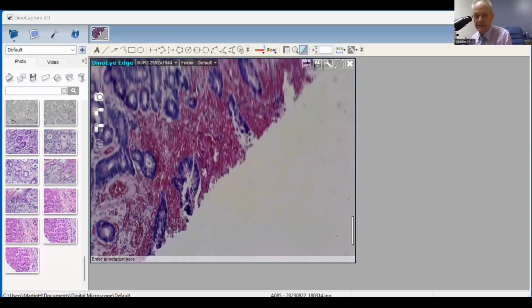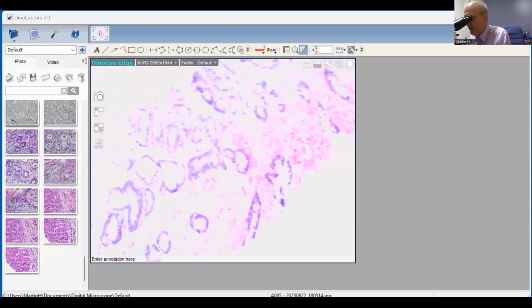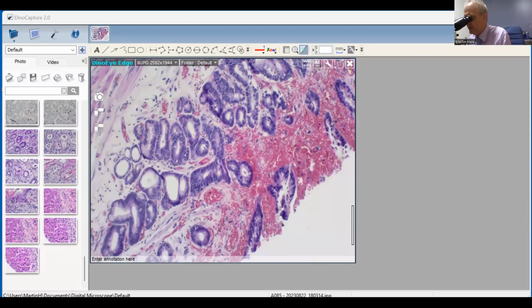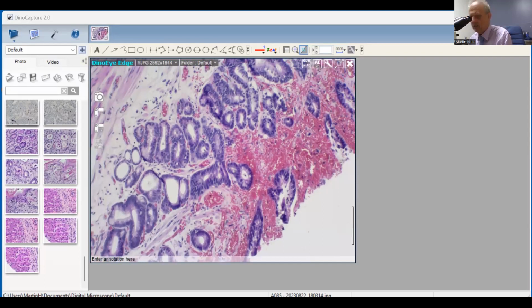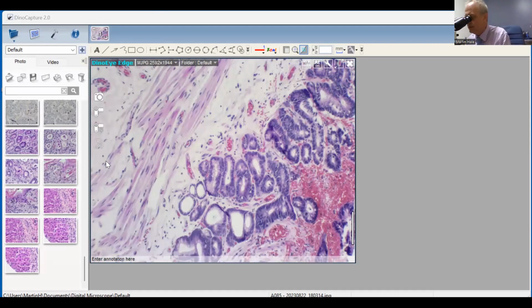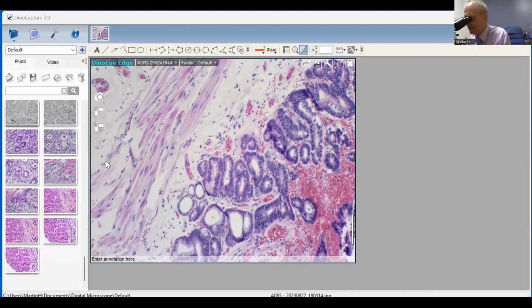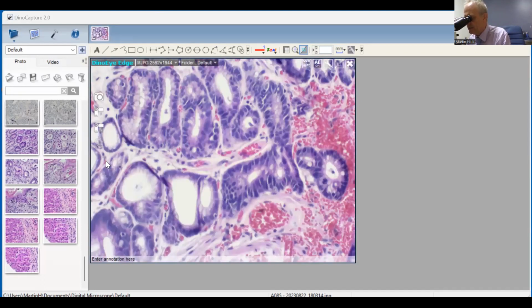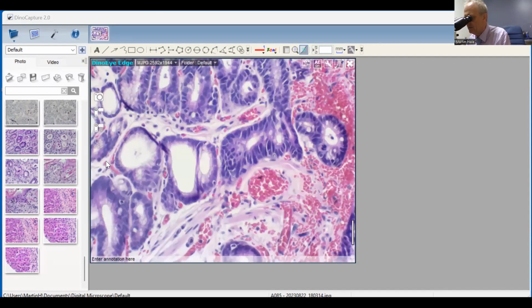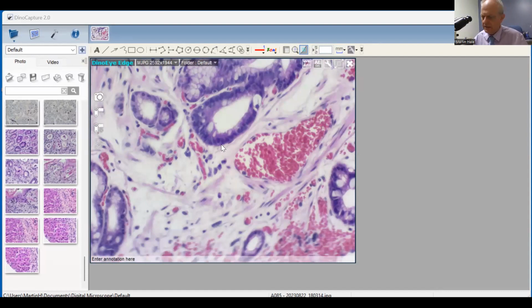Okay, there's the dysplasia. And Vikash was talking about RFA. You can see why the RFA doesn't work, because that's quite deep. There's the muscularis mucosae. And you're starting to get a bit of an abnormal architecture to these crypts. You've got extensive intestinal metaplasia in some of these crypts as well. So there's the intestinal metaplasia and the goblet cells.